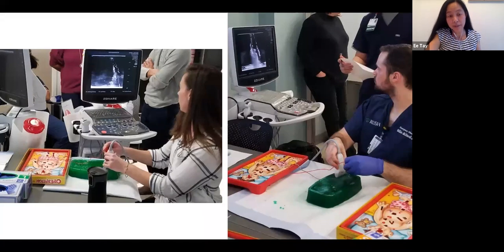So their vascular access phantom, and then they buried something in it, so you can use the probe from the Operation game to see if you can find the foreign body that's embedded in this gel. Once you touch it, it'll zap, and you can actually see the flash of the electrode on the ultrasound, indicating that you've made contact.